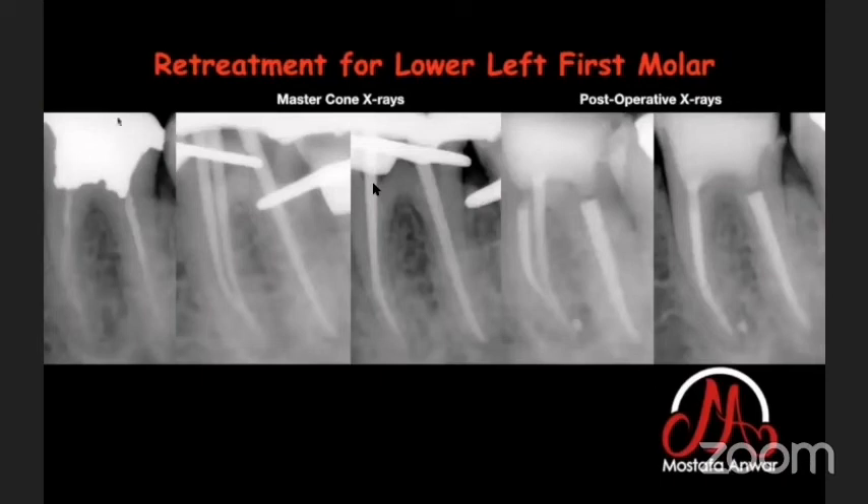In this retreatment of a lower left first molar, I had a lateral lesion. After finishing canal preparation and performing ultrasonic activation, the post-operative X-ray shows a beautifully filled lateral canal.